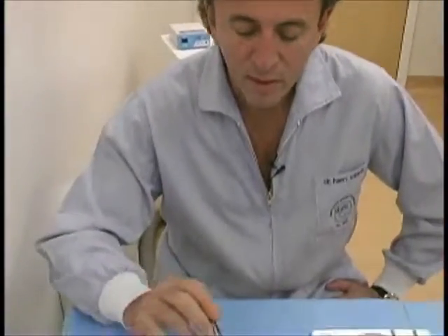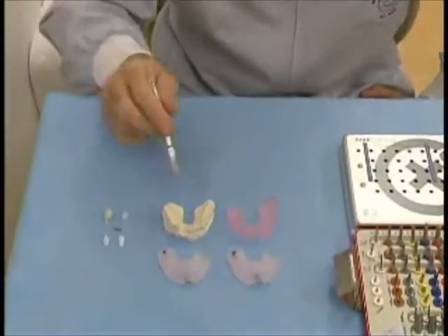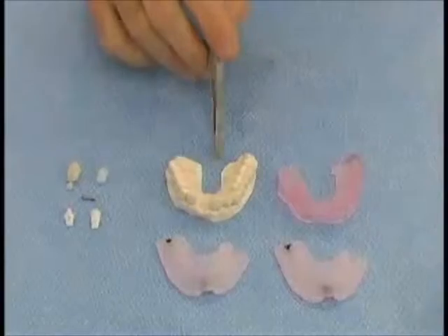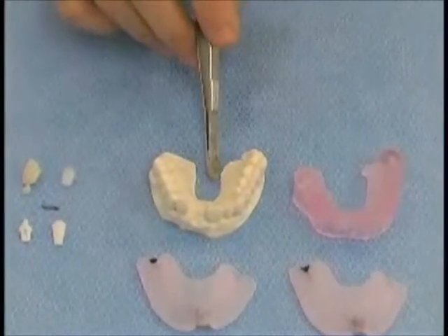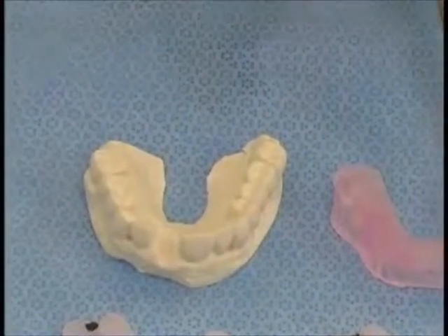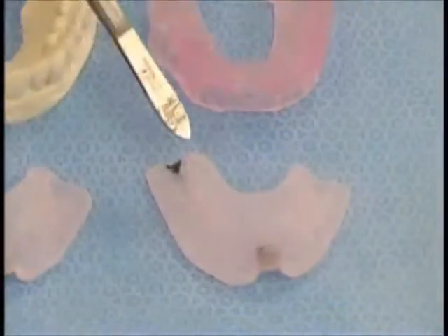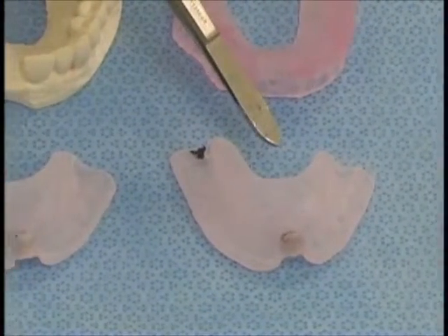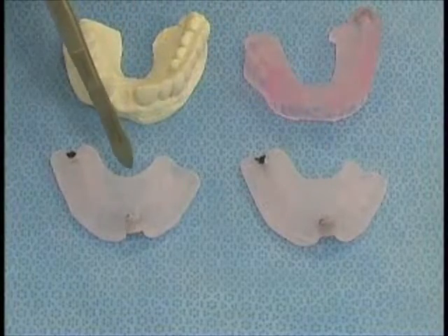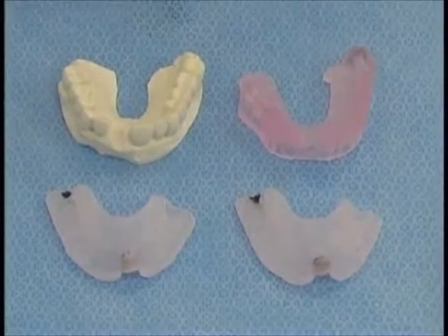It starts out with the model taken from the impression of the patient, and this is sent out along with a plan, a computer two-dimensional plan, to Implant Materialise, which makes us a stereolithic model and a set of stents depending on the drill sizes, the twist drill sizes, going from 2 millimeters all the way up to 4.5, depending on the size that's treatment planned for that implant.